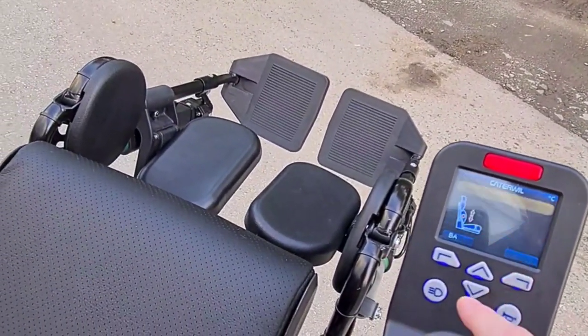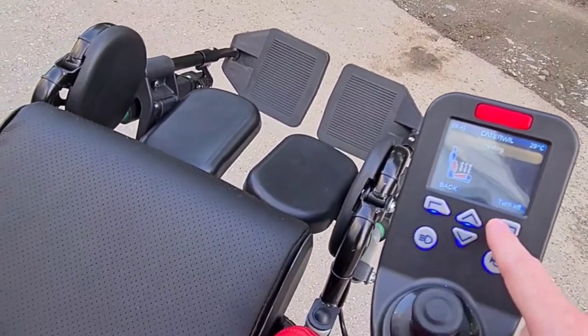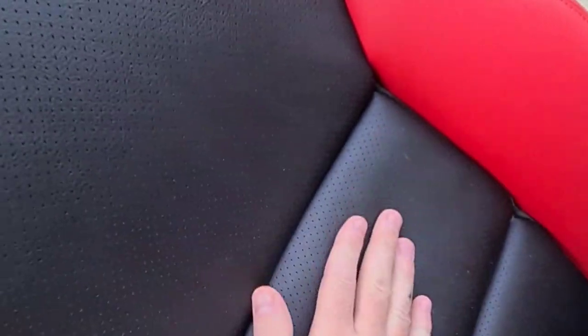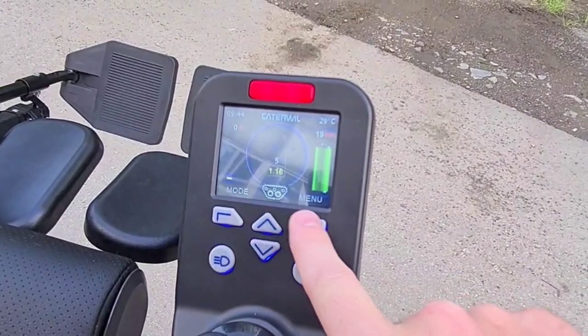And the heating — turn on and turn off. There is heating of the cushion and of the back side. Turn on and turn off. So this is how it works.